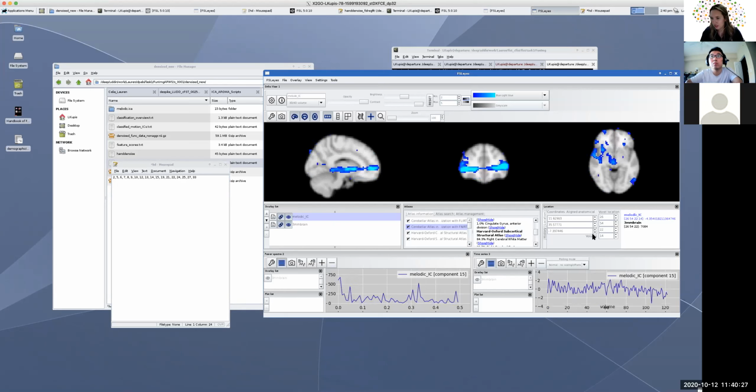One thing I noticed is that when you're clicking here, sometimes it can get out of order when you press this. It's just a glitch with FSL. So always double check when you're writing this stuff down, because sometimes it can jump up, like I noticed 3 volumes up from where I'm at, and that can mess up your flow if you don't check these. So that's just one thing to look out for.